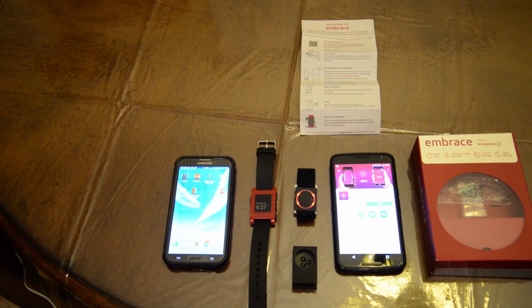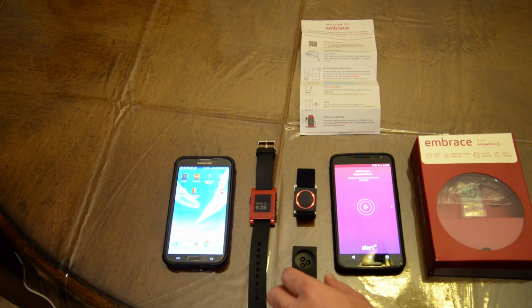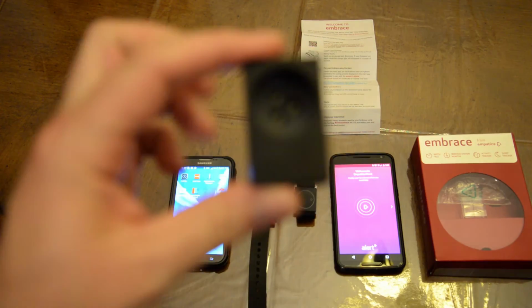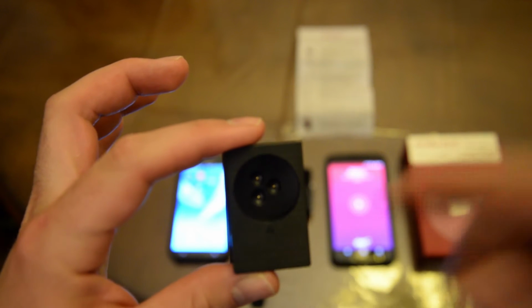Once the application installs, you'll want to open it and create your account. More than likely, you created an account before they sent it to you. While you're creating your account, you would want to charge it. It's kind of difficult to see here, but there is a little heart on the bottom of this Empatica. It's etched in.